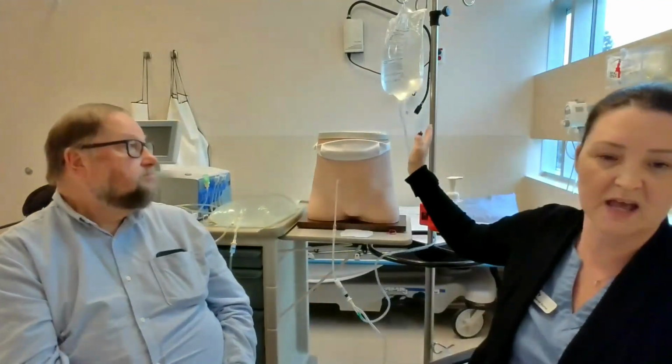Also, if the power was to go out on the machine, say it goes out for a couple of days and you're stuck, then we would say, hey, you need to go on the twin bags. And we always say, please have 2 weeks of supplies at home of the twin bags. So for this reason. Yeah, perfect. Exactly. It can be a pretty quick transition, but we want everyone to have that skill set.